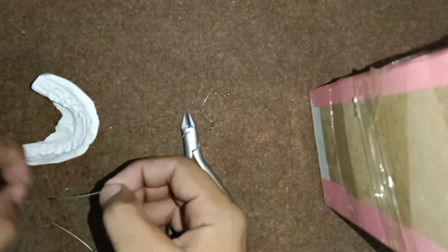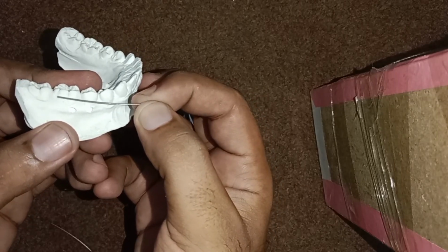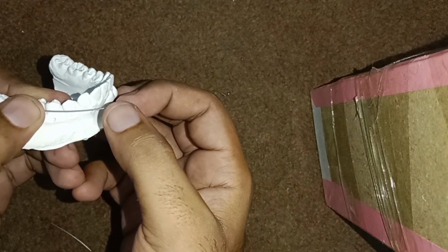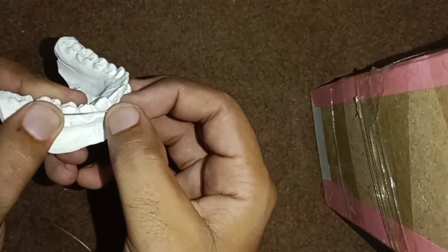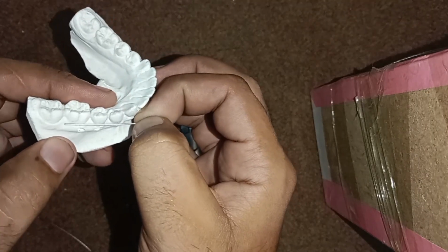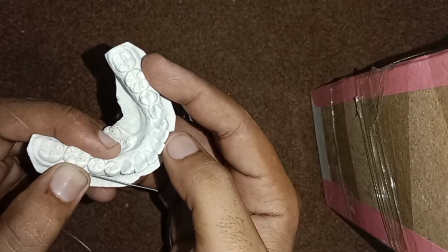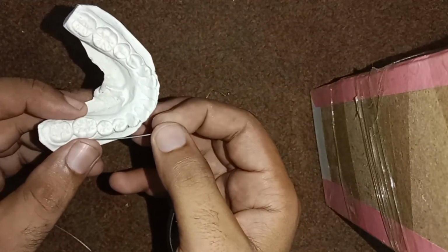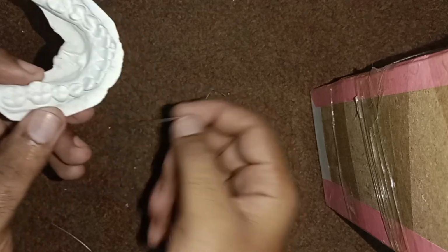Now we'll take a wire and place it in the main tube of the first molar, ligate it in the second premolar, first premolar and canine. This is the second piece of the 3-piece intrusion arch. We will bilaterally ligate the wire in right and left segments. So we have one segment that is ligated in the canine, first premolar, second premolar and molar's main tube.